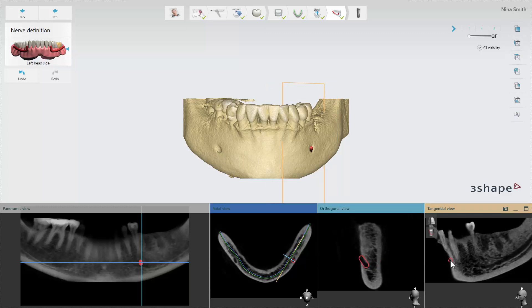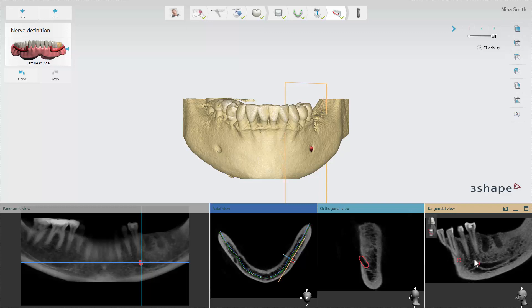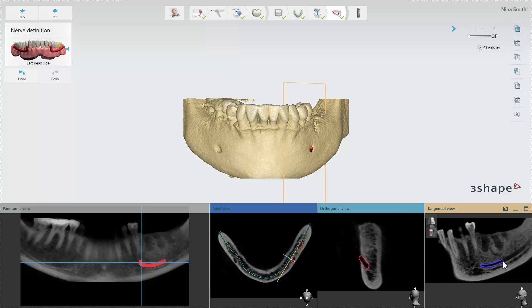In the tangential view you hold down the control button and scroll until the red circle appears, which is the nerve you have just defined. Keep scrolling until more of the nerve appears and you can keep clicking to define more of the nerve. The nerve canal is black in the CT scan since there is no bone here.